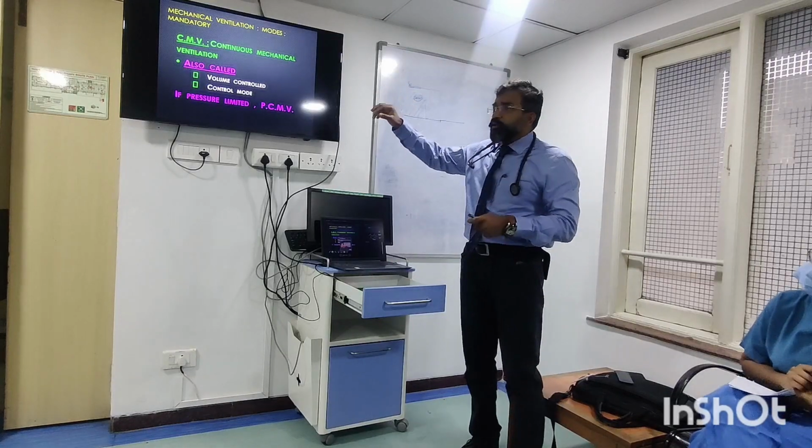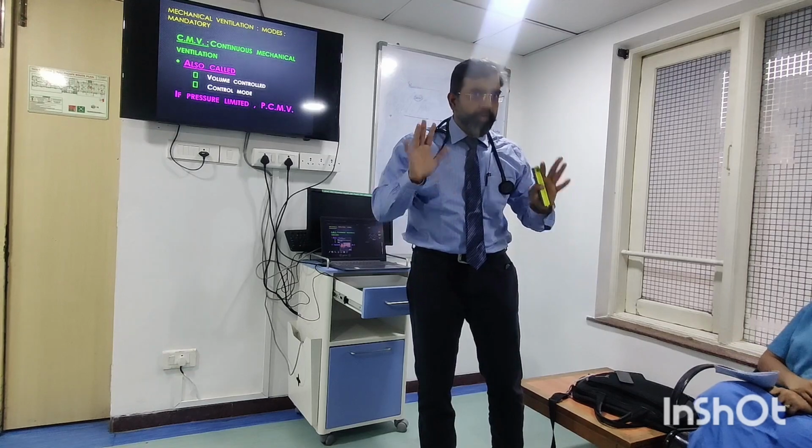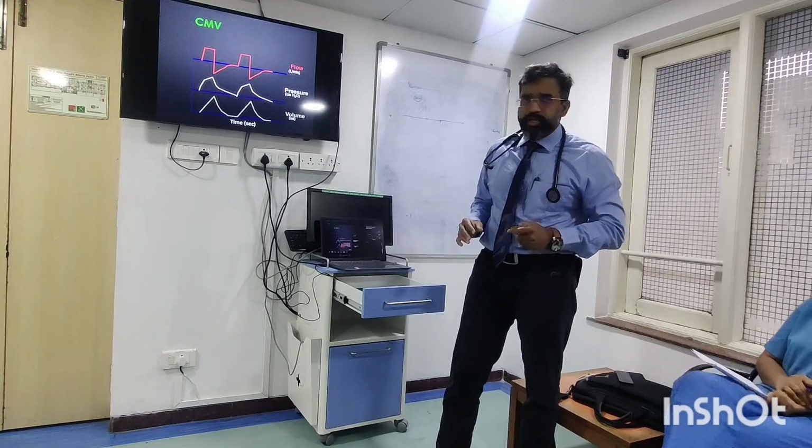Continuous mechanical, we can call it whatever you want to call it. But we are going to talk about a controlled mode, which means either volume controlled or it could be pressure controlled. All right. So now let's go to how it looks like.